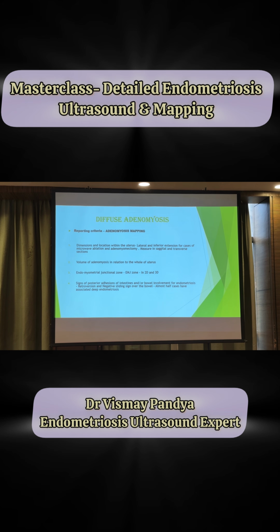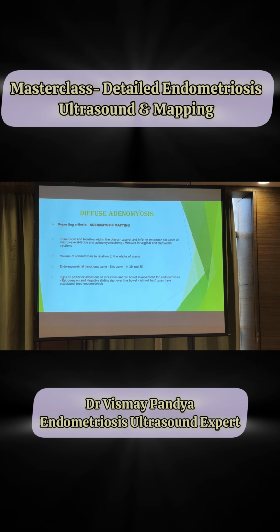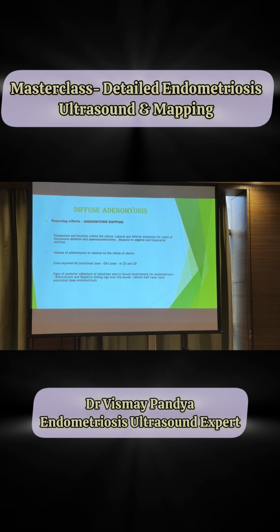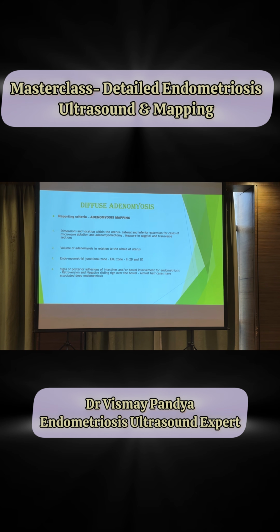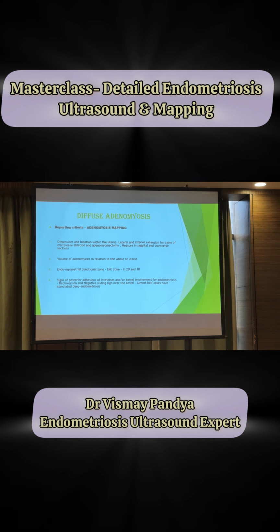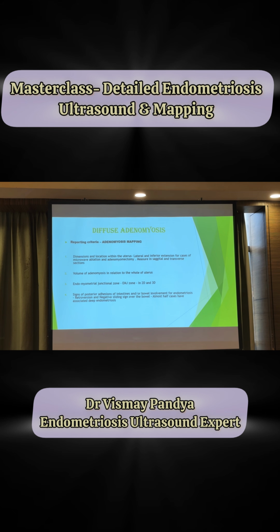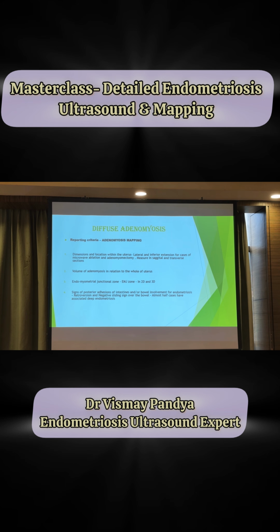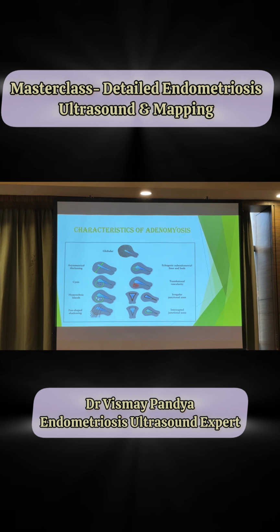Of course, now people are looking more into the endomyometrial junction or the EMJ zone. The EMJ zone is also visible very well in transvaginal sonography. Of course, much better in MRI, but even a good 2D or 3D can give you a very good EMJ zone. And of course, you need to rule out deep endometriosis also for diffuse adenomyosis, as there is a very high chance of adenomyosis in such cases.